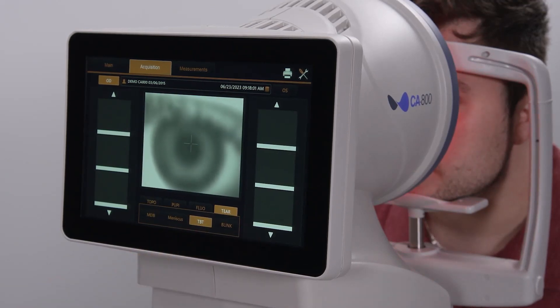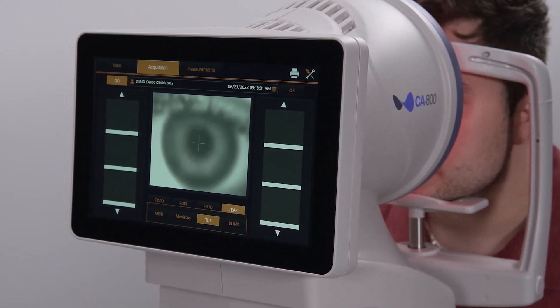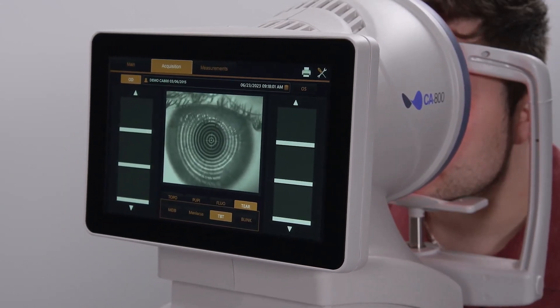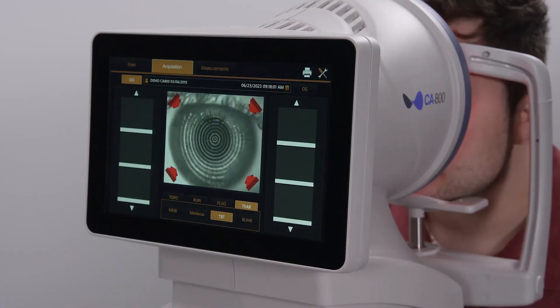With the patient positioned comfortably, instruct them to look at the target in the center. Use the joystick to move the CA800 towards the patient until the rings projected onto the eye are clearly in focus and centered on the cross target. The patient can blink normally at this time. Press the joystick button to activate the positioning guides.